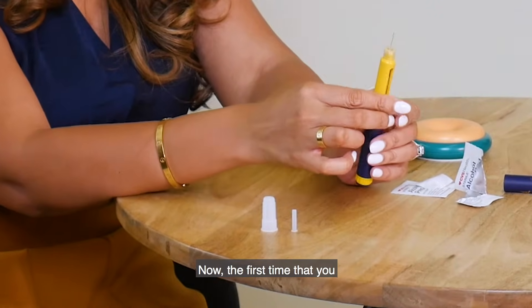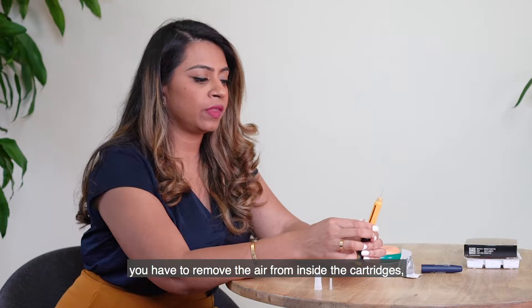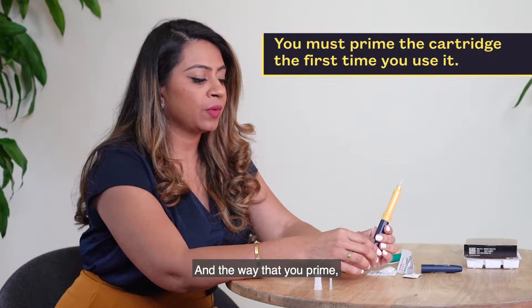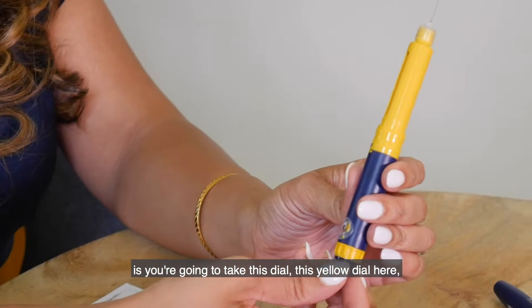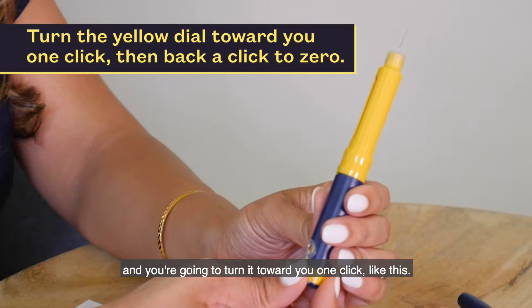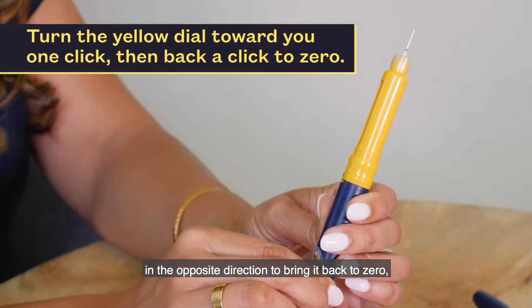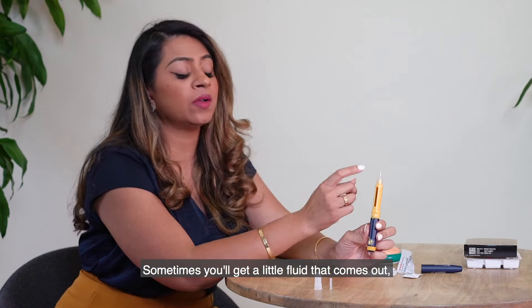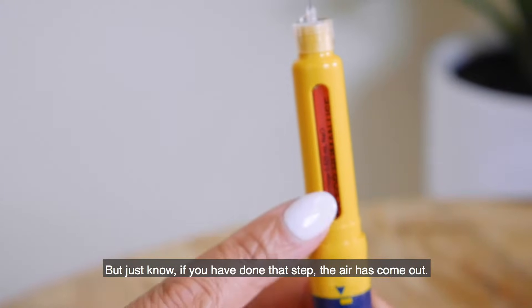The first time you assemble the cartridge into the pen, you have to remove the air from inside — that's called priming. To prime, take this yellow dial and turn it towards you one click, then push it back in the opposite direction to bring it back to zero while holding the pen upright. Sometimes you'll get a little fluid that comes out, sometimes you won't get anything, but if you've done that step, the air has come out.